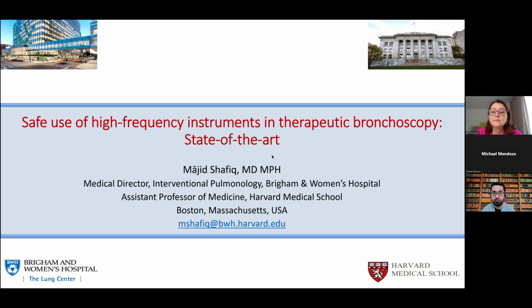question is going to be, what are the current vascular pressures? If the intravascular pressure is actually really high and healthy, it might actually be better than that of a patient who is undergoing mechanical ventilation, typical anesthesia, and is a little bit hypotensive when you're doing it. When the patient's hypotensive, you worry about that differential gradient, allowing more gas to enter from the airway into the vascular space. However, if your ECMO setting is such that your pressures are fairly healthy and robust, then maybe the gradient has actually improved, and now there's a lesser chance of the gas entering from the airway into the vascular space. However, we all know with ECMO, that's not always the case. So I wouldn't worry about it, but I would say the same good principle applies. Make sure we are sufficiently away from the site that you're treating. Never be touching the tissue that you're treating, and keep the flow rates as low as possible.